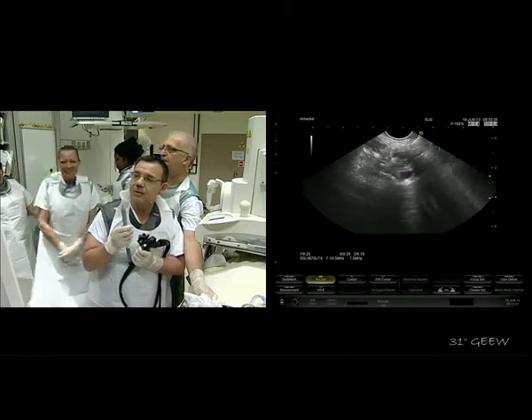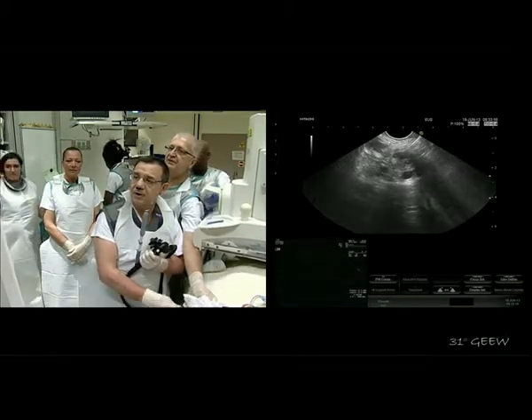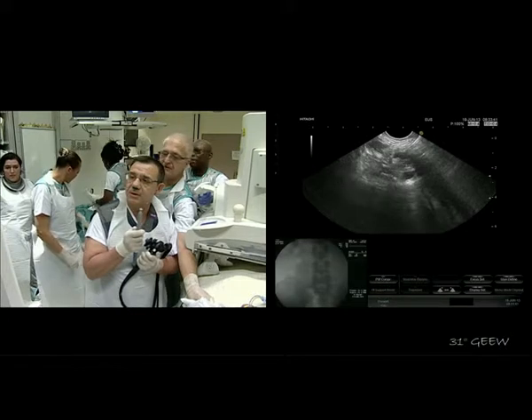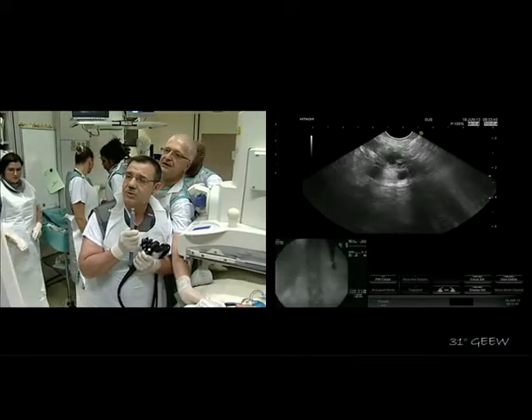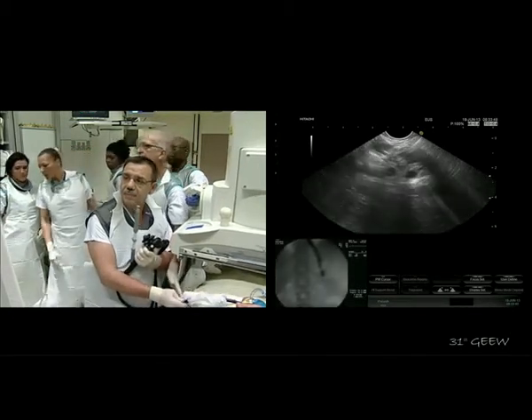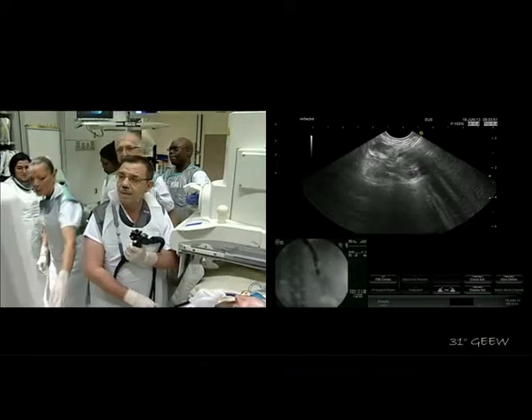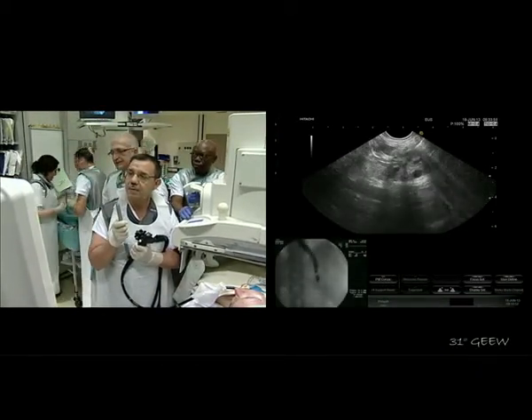Okay. Sami, if we can have the fluoroscopy. I will try to see if the needle is a little bit too... If you want me to go on the other side, I can do that.